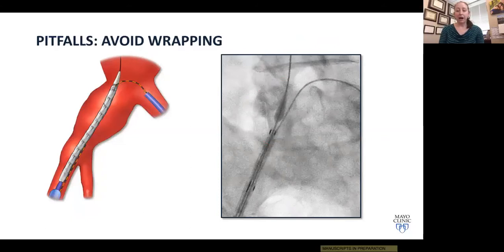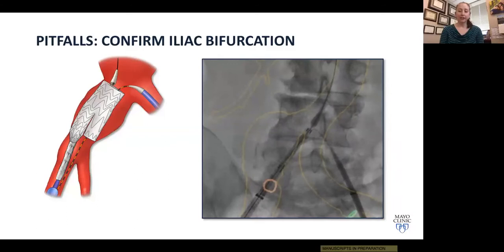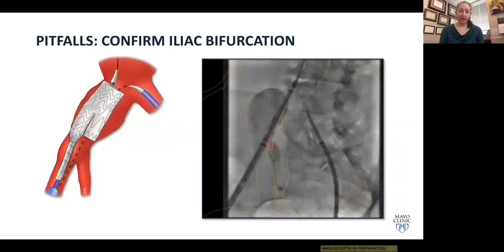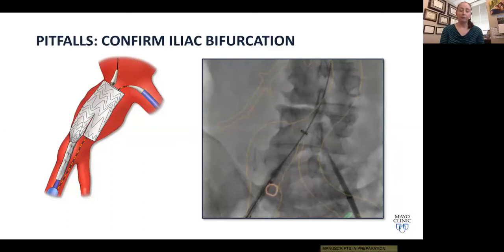Position the device so that the gate or lower marker is about 1 to 1.5 centimeters above the iliac bifurcation, then withdraw your sheath back down below where you think the bifurcation is. We confirm the location of the iliac bifurcation using onlay fusion — the orange ring shows the estimated location — and then confirm with contrast before the first-stage deployment. For large positional adjustments, confirm the origin of the hypogastric artery with contrast before first-stage deployment. Here we've deployed and placed the gate right where we wanted — approximately 1.5 centimeters above the origin of the internal iliac.